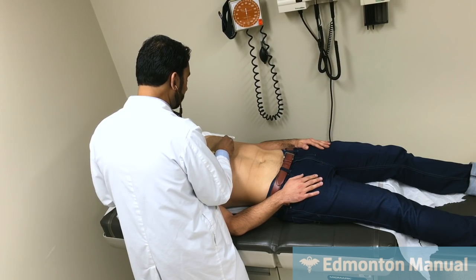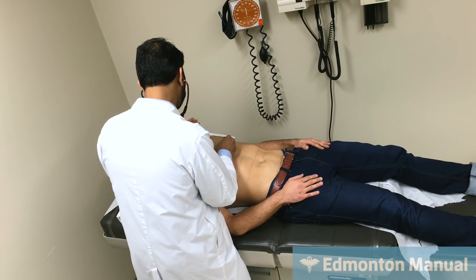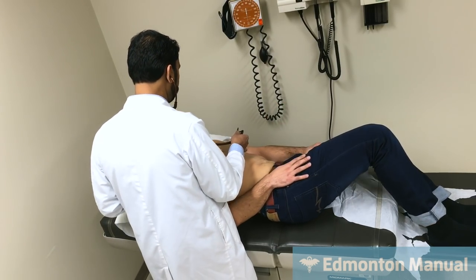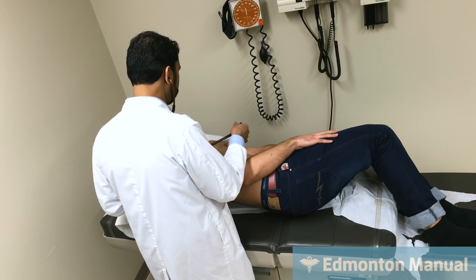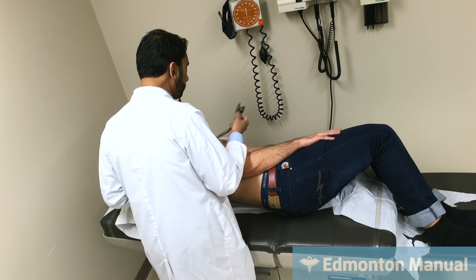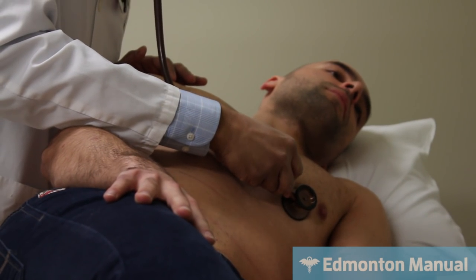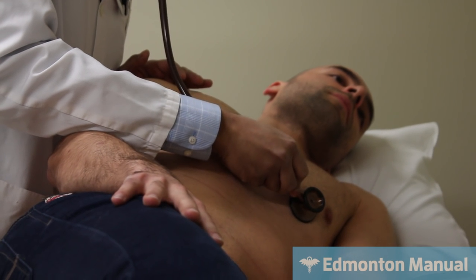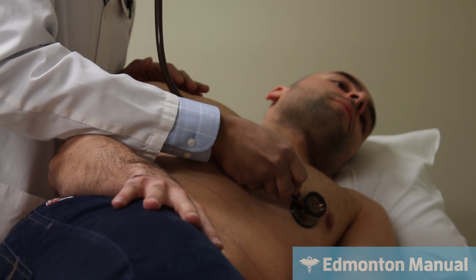And then what I'm going to get the patient to do, could you please roll away from me a little bit? Okay. That's good, just like that. Good. 45 degrees. Sorry, a little bit more. Perfect. Okay. And then there's two options. I can just keep listening. This is still diaphragm. And then push a little lighter. And then essentially, I'm using it like a bell.